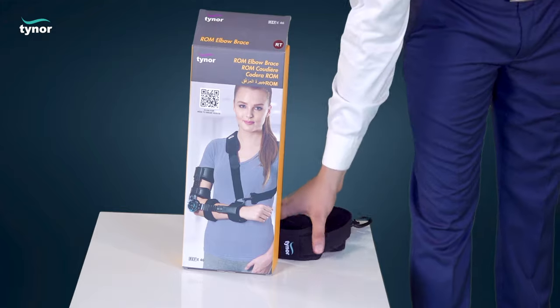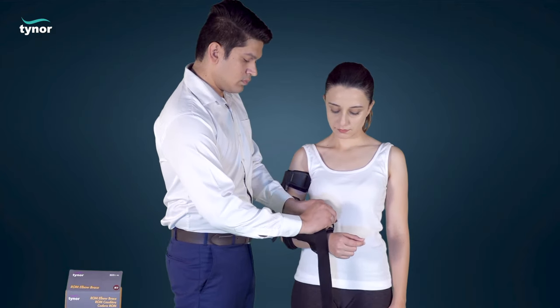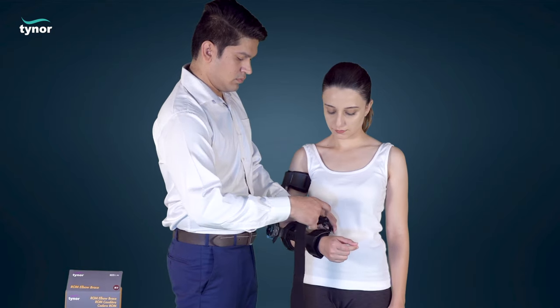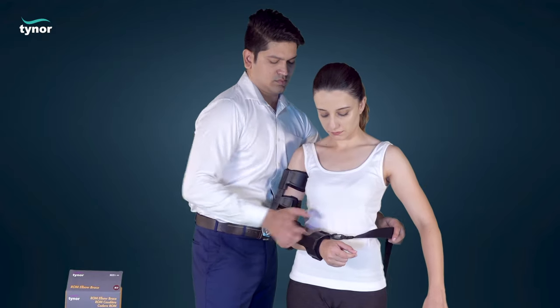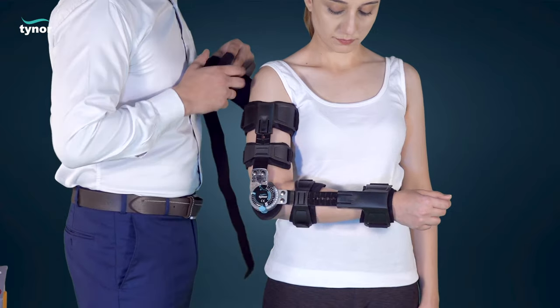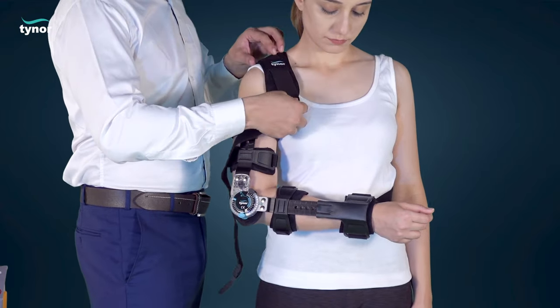In order to wear the optional arm sling, apply the strap having length adjustment arrangement with the debuckle provided in the wrist cuff strap. Bring the other loose end of the sling strap over the shoulder of the same elbow side and under the opposite side arm. Now hook the same with the debuckle.